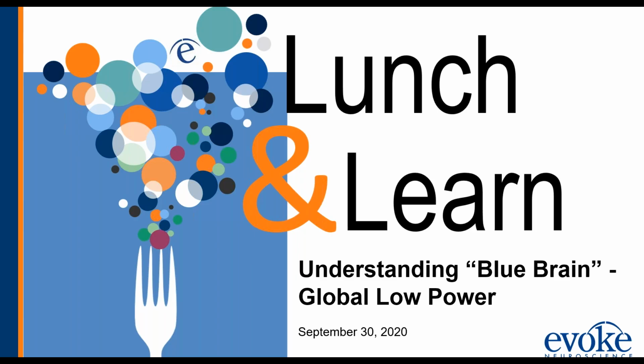So today we're going to be talking about understanding blue brain, which really is global low power. I'll explain what that term means, but blue brain, as you might suggest, is just blue all over the brain for basically all of the frequency bands we're interested in. So we're going to dissect why that can be seen, what different types of disease states cause it, and then get into different treatment and therapeutic approaches for it. And that's where Dr. Finney will come in and share some of his case studies.